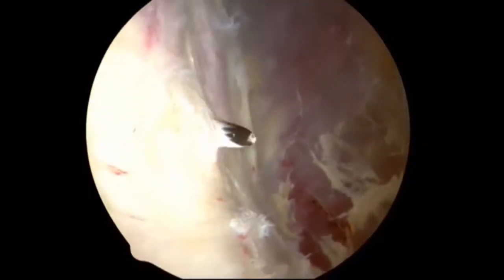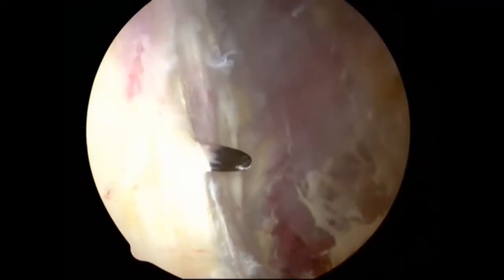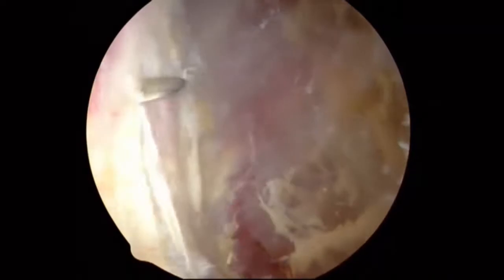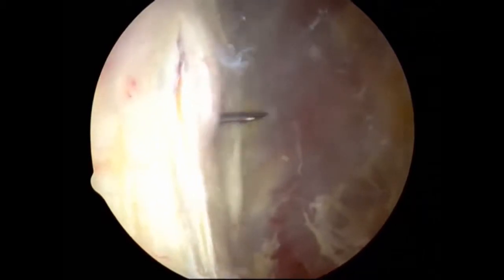Orientation to these structures is important while completing the iliotibial band tendoplasty. A vertical incision is begun, typically 6 to 10 centimeters in length, and this is paired with two transverse incisions in the iliotibial band.